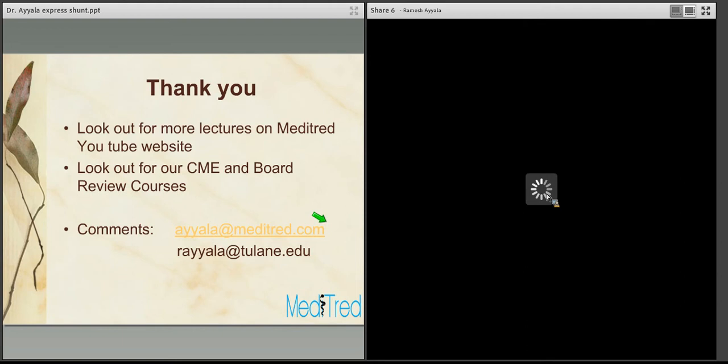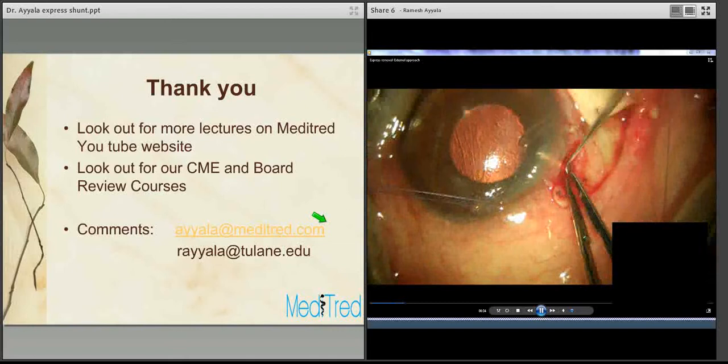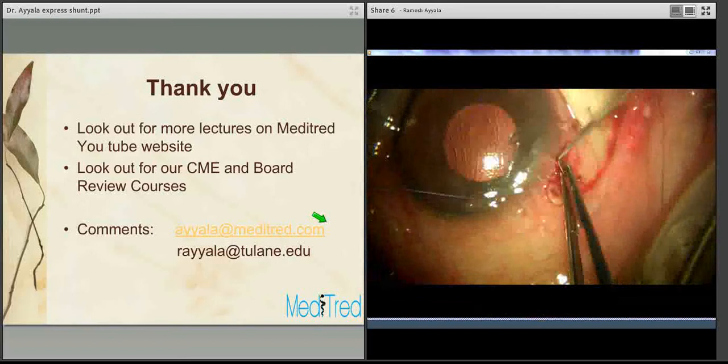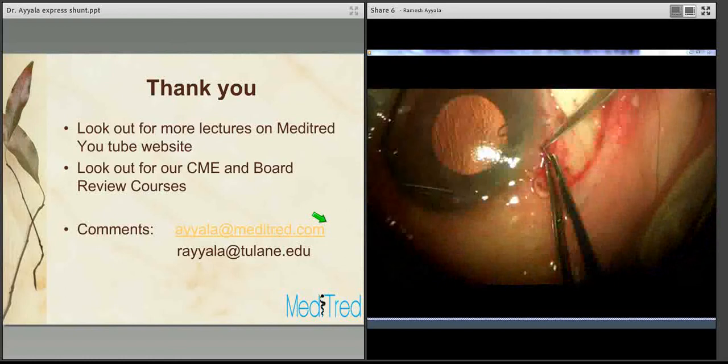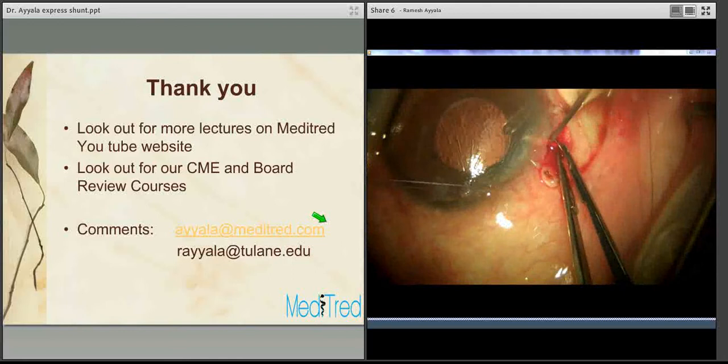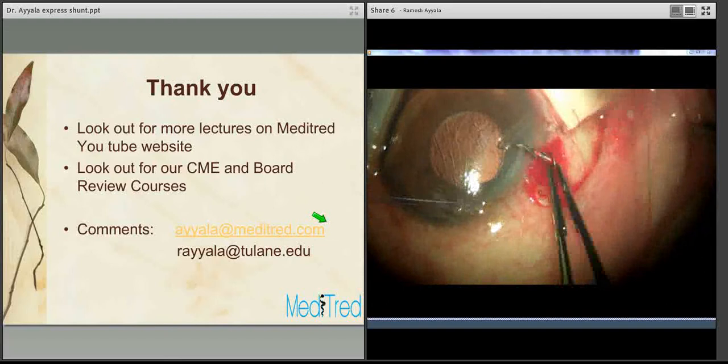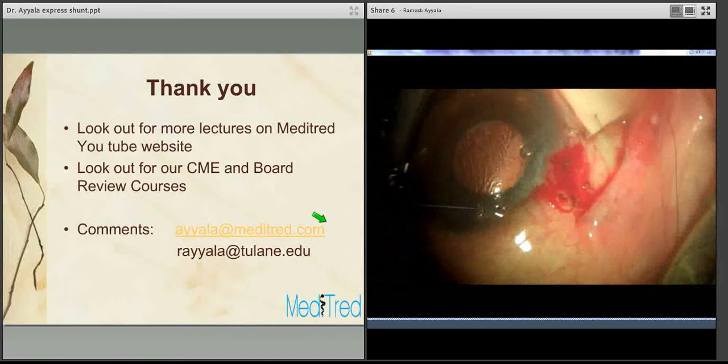This video demonstrates how to remove the Express externally. The conjunctival dissection has already been performed, and you can see an Express that has extruded through the conjunctiva. Using a 15-degree blade, extend the incision on either side of the Express Shunt, creating about a one-millimeter full-thickness incision on each side. Then twist the Express to make the spur parallel to the incision, and it will come out easily. Once it's out, close the incision with a figure-of-eight suture and close the conjunctiva.